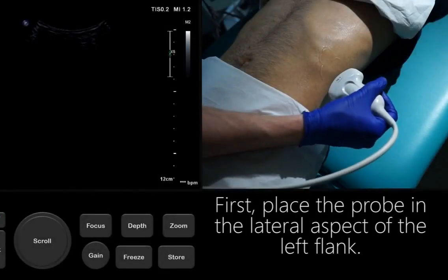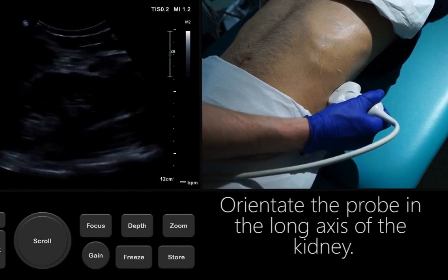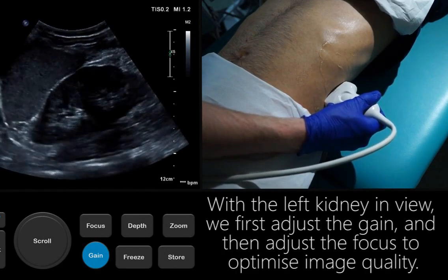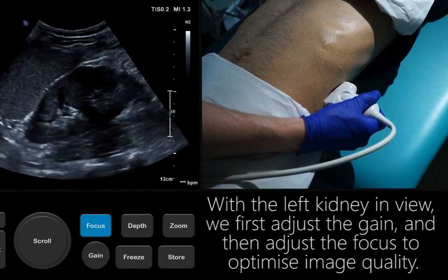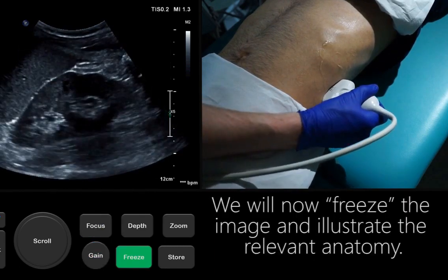First, place the probe in the lateral aspect of the left flank. Orientate the probe in the long axis of the kidney. With the left kidney in view, we first adjust the gain and then adjust the focus to optimize image quality. We will now freeze the image and illustrate the relevant anatomy.